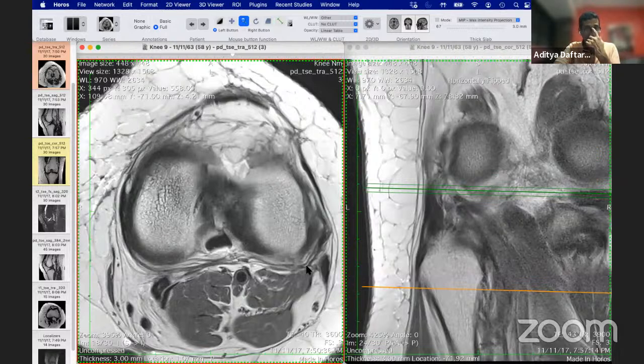What if there is a stainless steel and titanium plate? It's no problem. We can scan them. There is nothing to stop you from scanning orthopedic implants. We do get more artifact with them. There are ways to mitigate those artifacts by using special sequences and special techniques that are available. I think that just depends on your individual MRI center being able to do that.